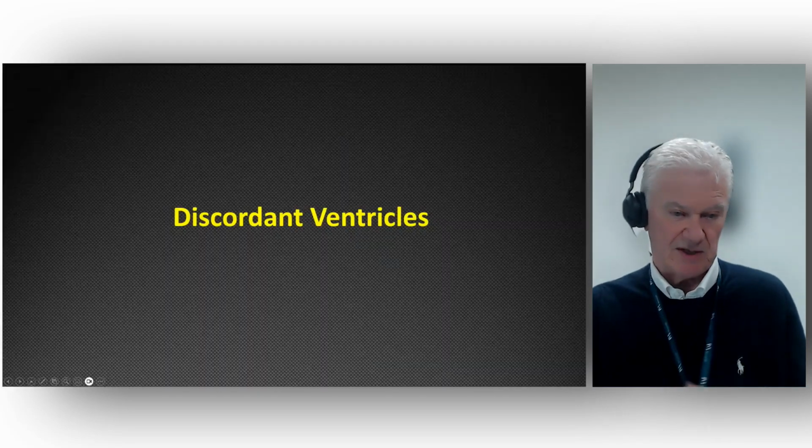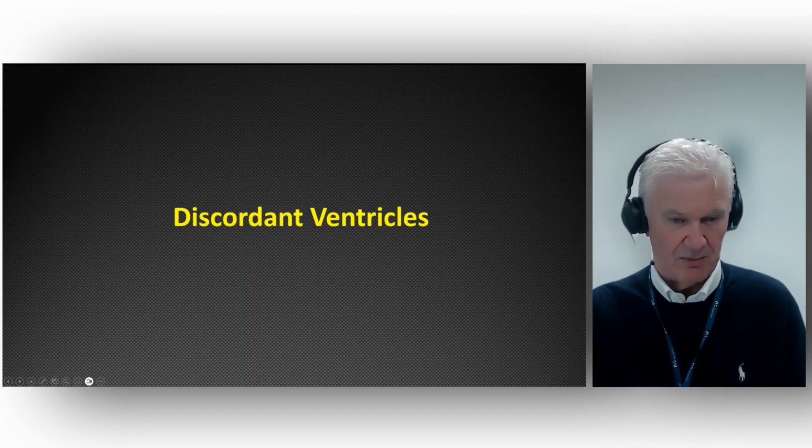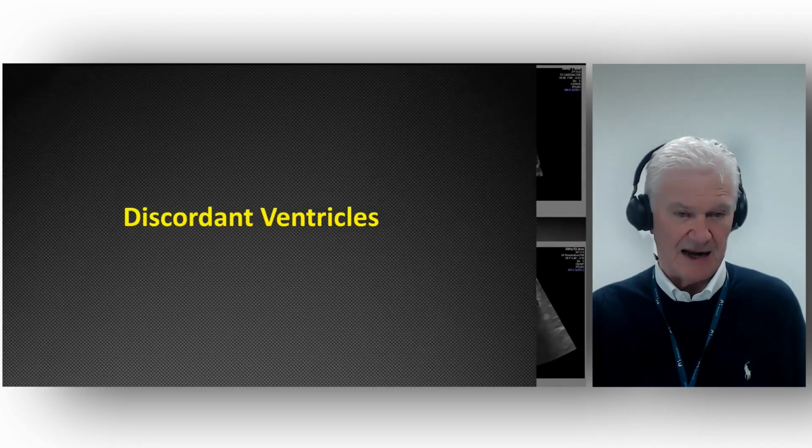What about doing a third trimester scan and seeing discordant ventricles? Well, you all know you're faced with that when you go to work tomorrow morning. It's part and parcel of routine practice. You see that the right ventricle is bigger than the left.